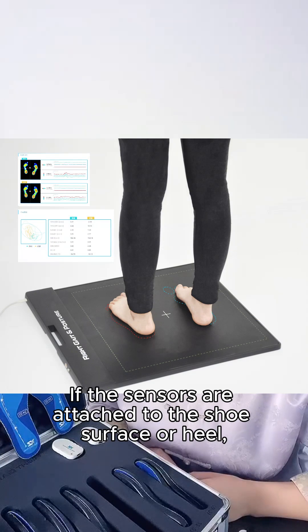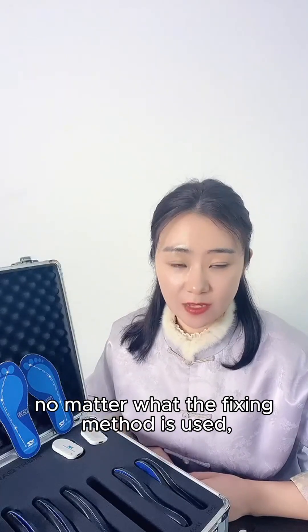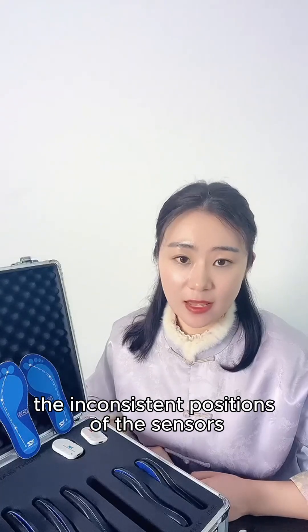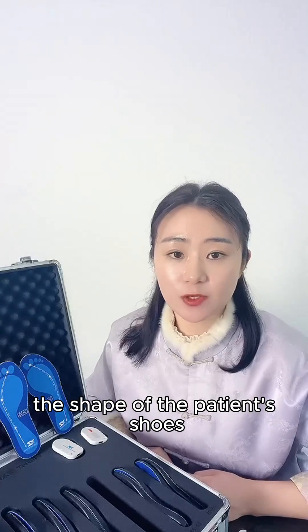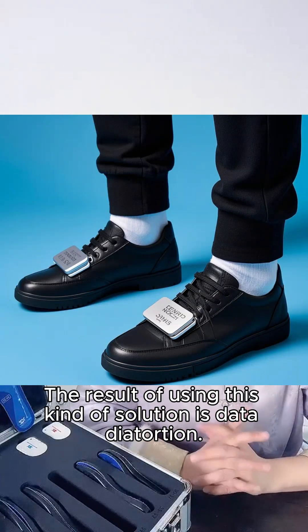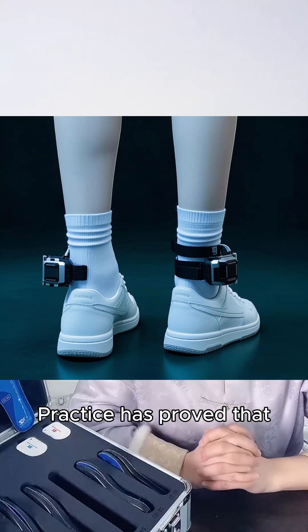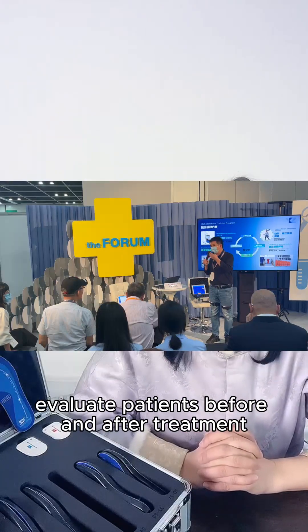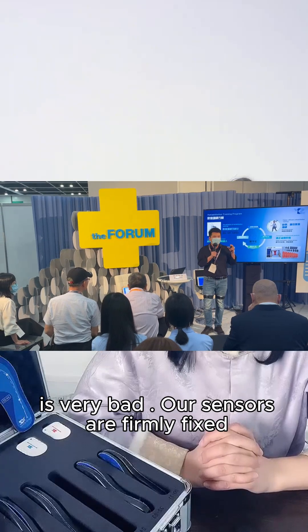If the sensors are attached to the shoe surface or heel, no matter what fixing method is used, it will be very difficult to avoid inconsistent sensor positions due to the operator's habits, the shape of the patient's shoes, and displacement during walking. The result of using this kind of solution is data distortion. Practice has proved that using the external sensor solution to compare and evaluate patients before and after treatment and record rehabilitation progress is very unreliable.